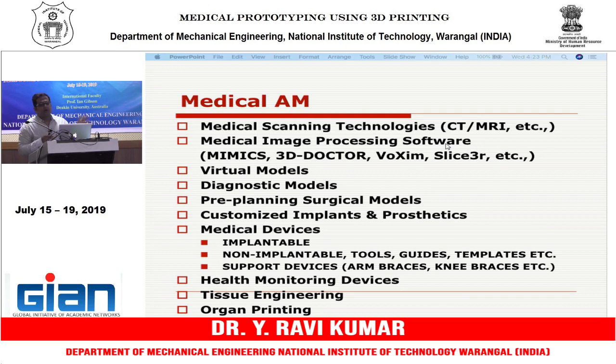If it is a bone, you may go with CT, and if it is soft tissue, the radiologist may suggest the appropriate scanning technology. Then you will be examined, you get a DICOM image from the radiologist, and you take that DICOM image and then we need to process it.